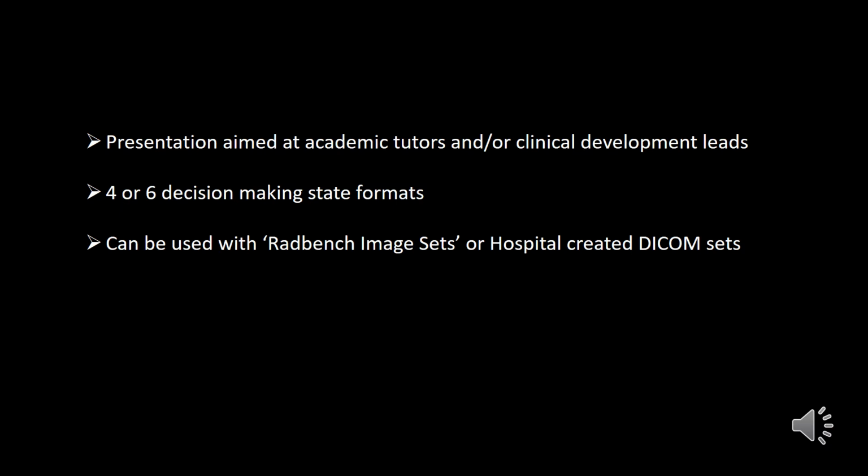Hello and welcome to how to use RadBench tests. So this presentation is aimed at academic tutors or clinical development leads, anyone who is trying to develop the clinical skills of their staff in the domain of image interpretation.